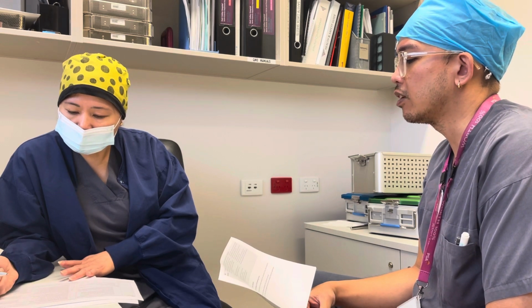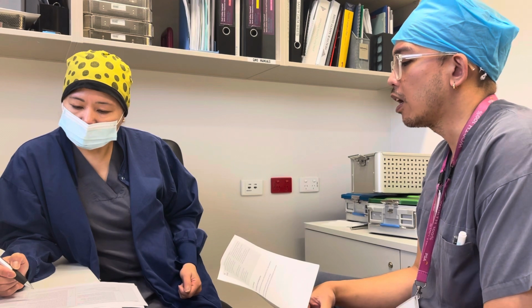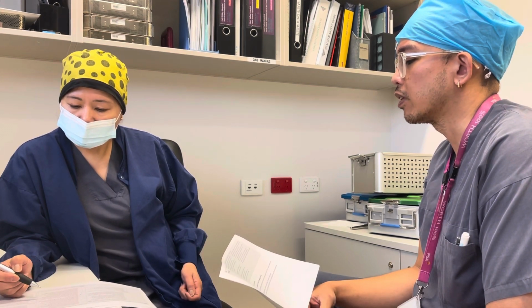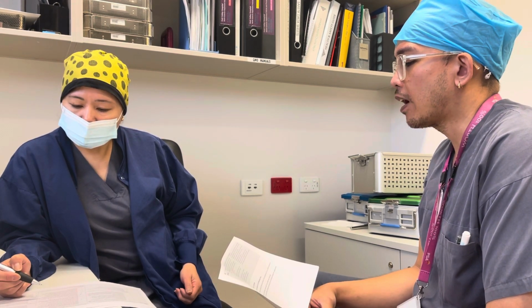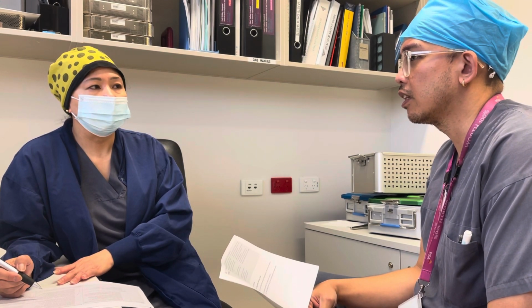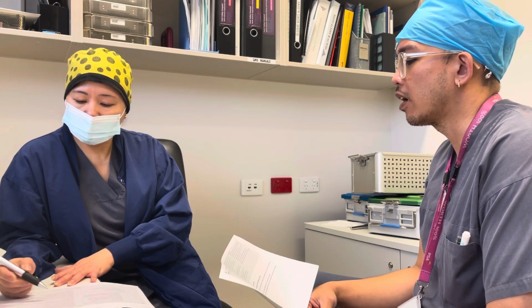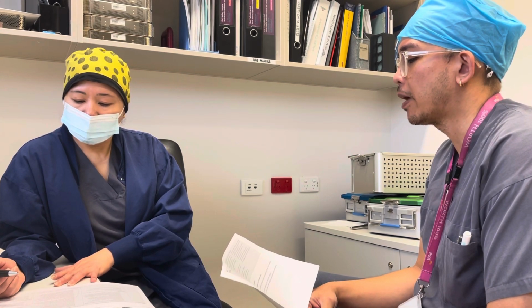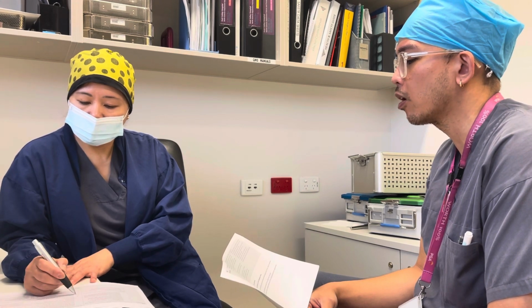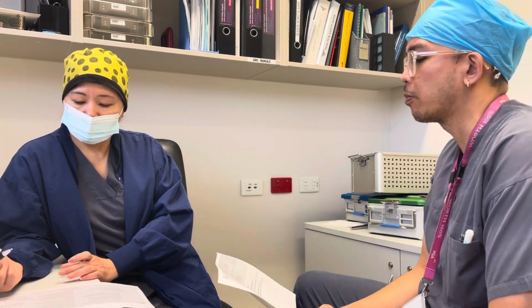Much of the standard applies to sterile departments, probably with the exception of Section 6, which refers to restraints and seclusion. Additionally, certain criteria such as in Section 2, where the standard requires the service providers to develop and implement a risk-based quality management framework, are amongst many key areas that HSOs such as sterile departments must focus particularly on.